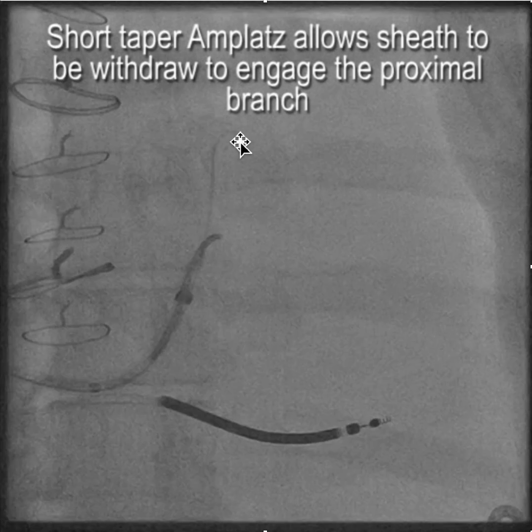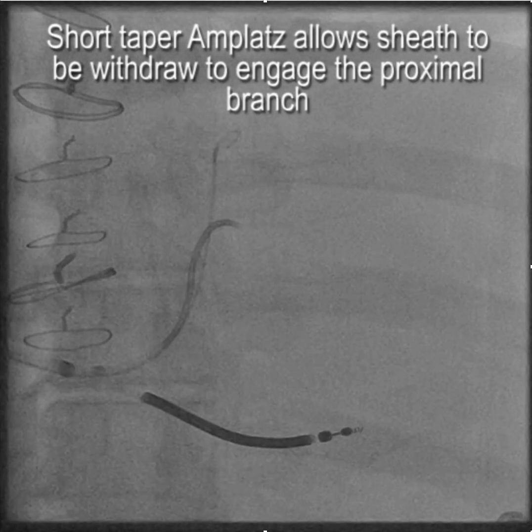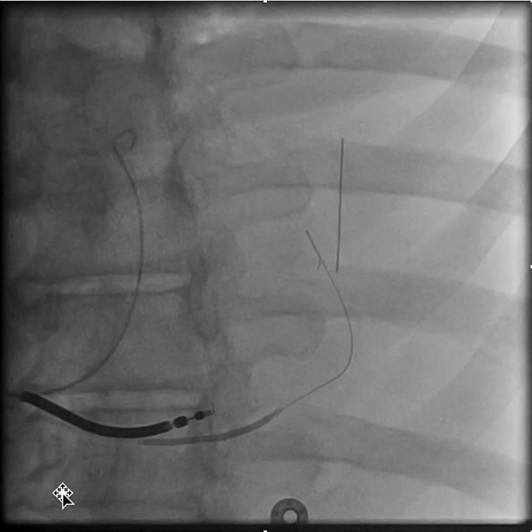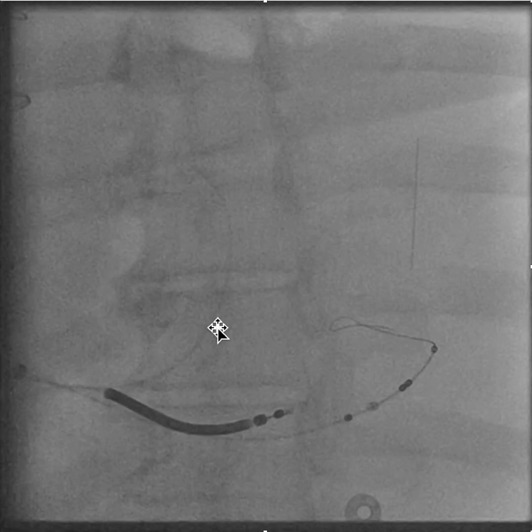What we're doing here is we have the Amplatz support wire in place, and remember there's a branch down near the ostium of the coronary sinus, so we simply slide the sheath way back. This allows us to bring the vein selector down and engage the side branch — the posterolateral branch — near the ostium. The Amplatz wire holds everything in place.